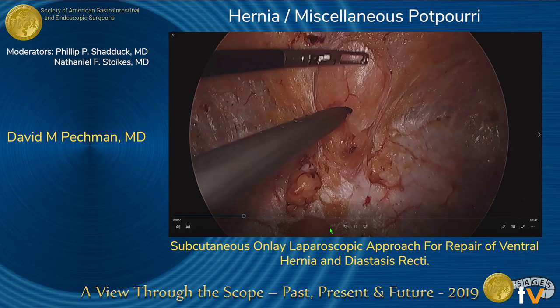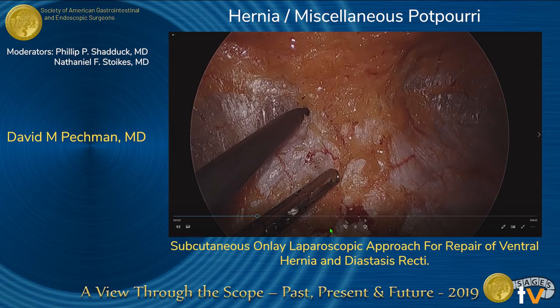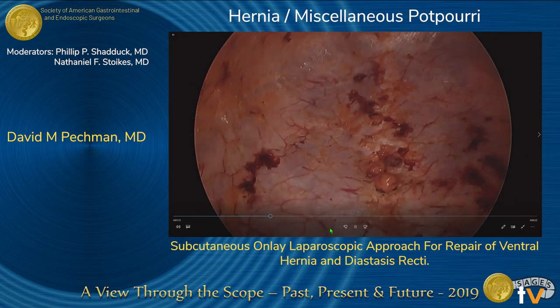As the dissection was extended towards the xiphoid and costal margin, care was taken to avoid injury to the fascia and to cauterize perforating vessels as they were encountered. The costal margin is visualized. A needle was inserted just below the xiphoid to confirm its location.